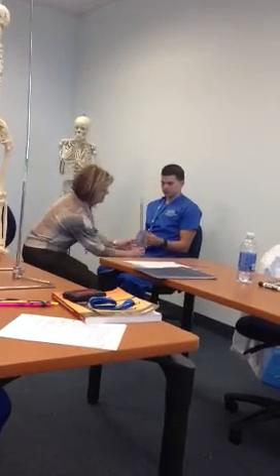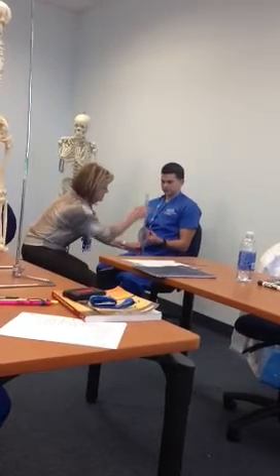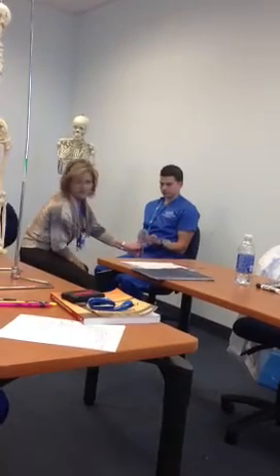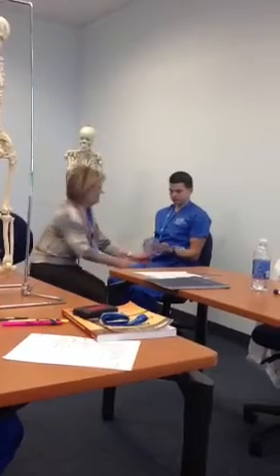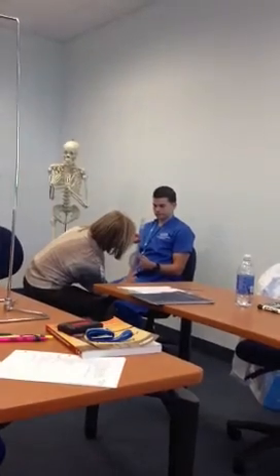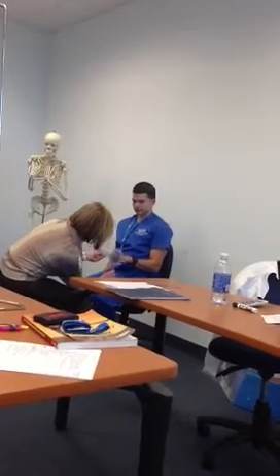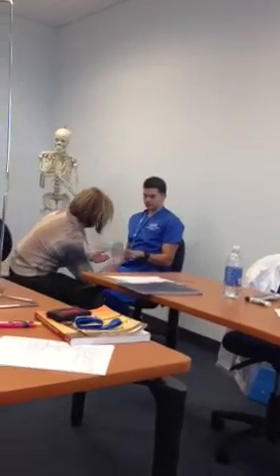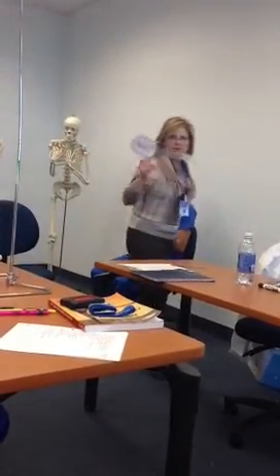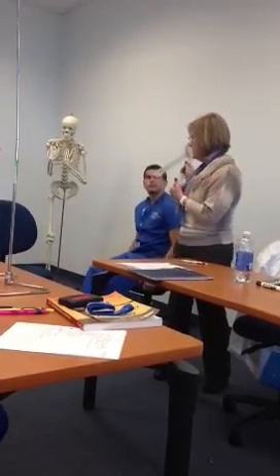Okay. So we align it like this, and we're going to ask the patient, go palms up. So I'm going to align that pen, 90 degrees. See it there? Okay, go back to neutral. And for pronation, go down. Nice. Okay. So that's why for me it's a lot easier to see the planes and the axis when I'm doing goniometry.